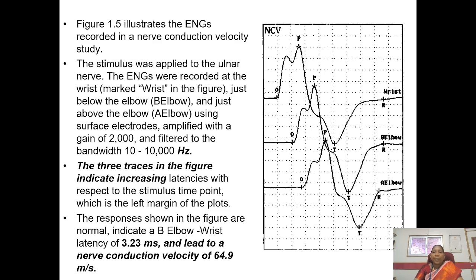If you measure the nerve conduction velocity in different regions like wrist, below elbow and above elbow, you can see there is some time lag, latency, in each waveform.